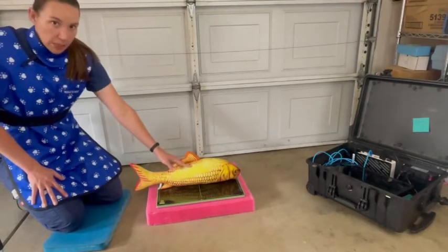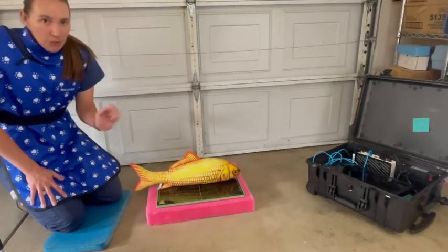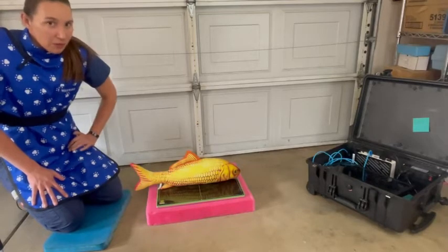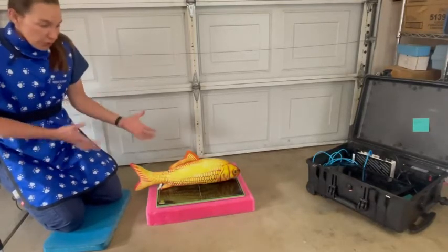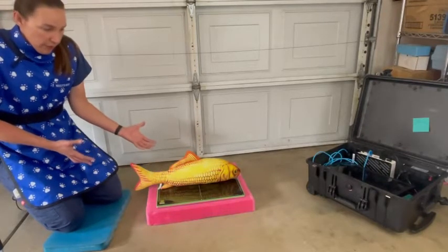When you're working with a big muscly torpedo, they don't like to hold still and it's really hard to restrain them and make them hold still, so we use a lot of chemical restraint, which is what we're doing with the x-rays and radiographs.